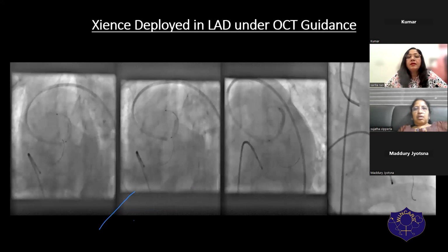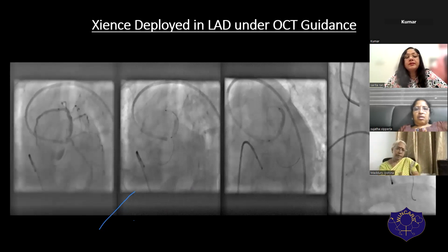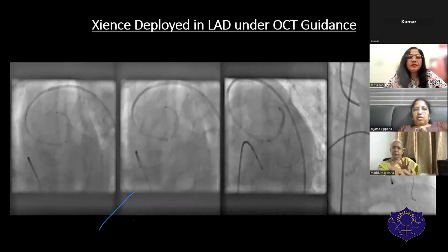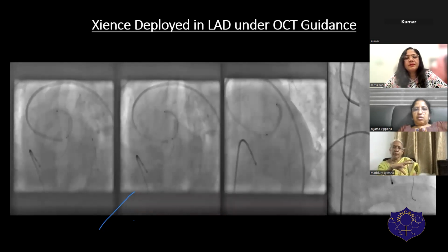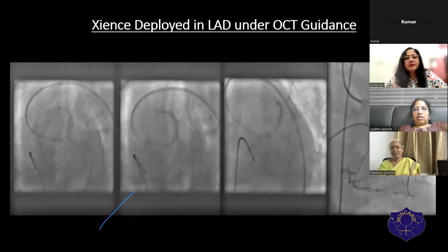So the cutting balloon was taken. The cutting opened up well. Now we went in with a 3.5x48 stent deployed. Is taking the Wolverine now better than in the initial step? Yes, absolutely, because you have already created some breaks. So then Wolverine acts much better. With that much calcium in the initial stage itself, it may not be able to give that much. It is a guess. What we say is that it depends on the degree of the calcium.